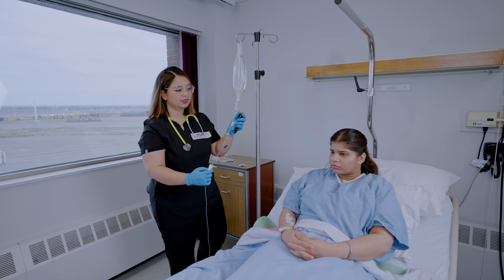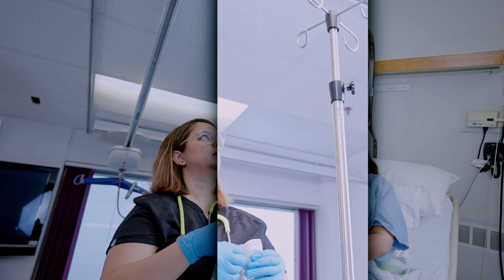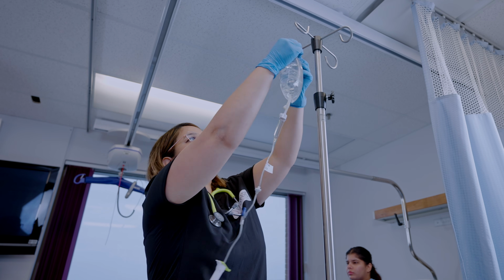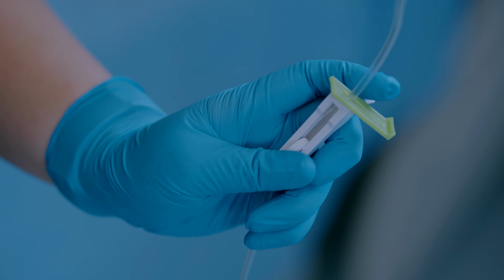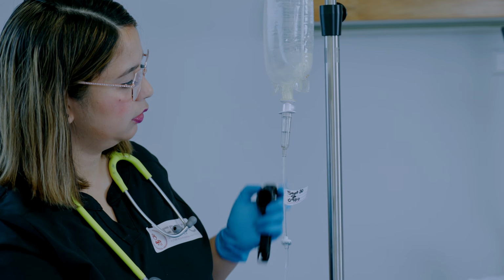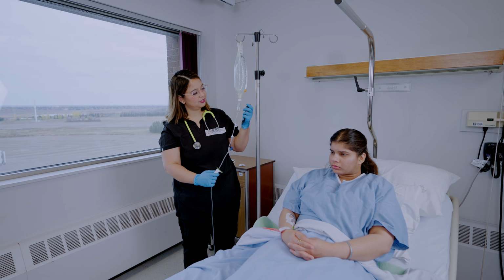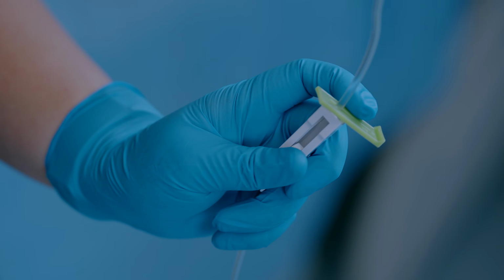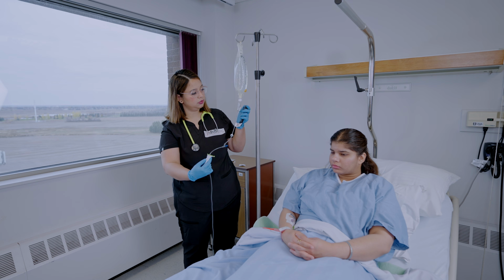Now, let's see how to set up these 21 drops per minute on the patient. Make sure that your bag is ready and hanging on the IV pole, and your tubing is all primed and ready to go. Make sure that you have a stopwatch or a watch with a second hand ready, and then slowly and gradually you turn the roller clamp on. You can also estimate and see that you are getting approximately 21 drops per minute.